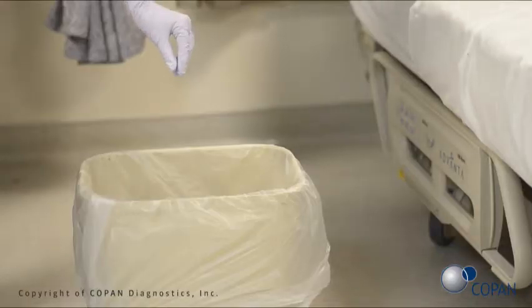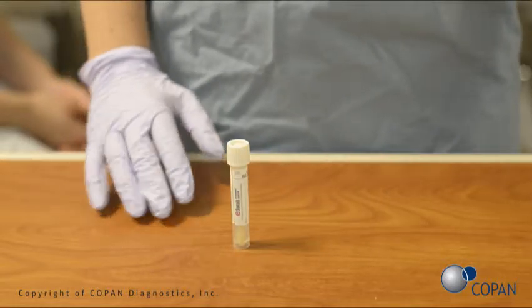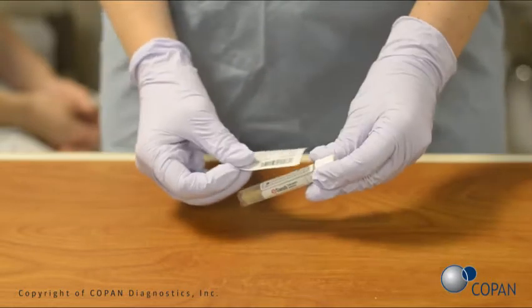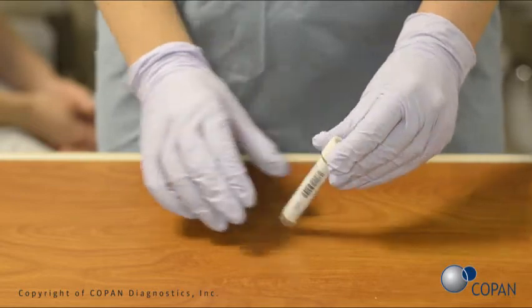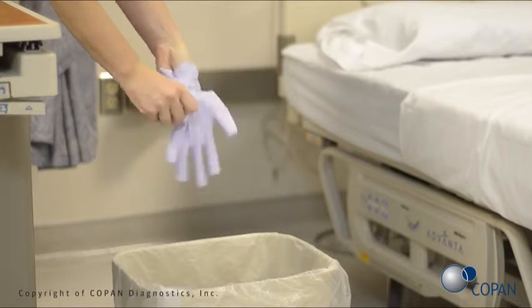Dispose of the top of the swab stick in a regular trash can. Apply the patient identification label. Remove gloves and perform hand hygiene.